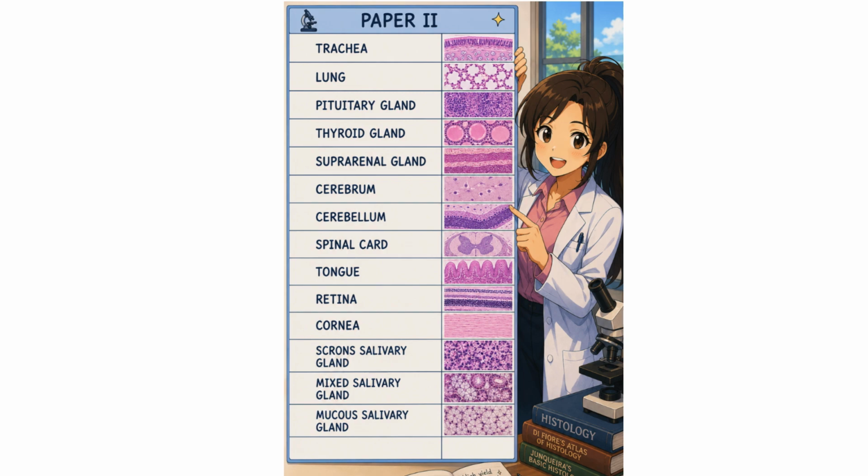Then is Bowman's membrane, then stroma, then Descemet's membrane, then endothelium. And avascularity is a hallmark identification point. And stroma has regularly arranged collagen fibers, which is responsible for the transparency. This is your important viva question.